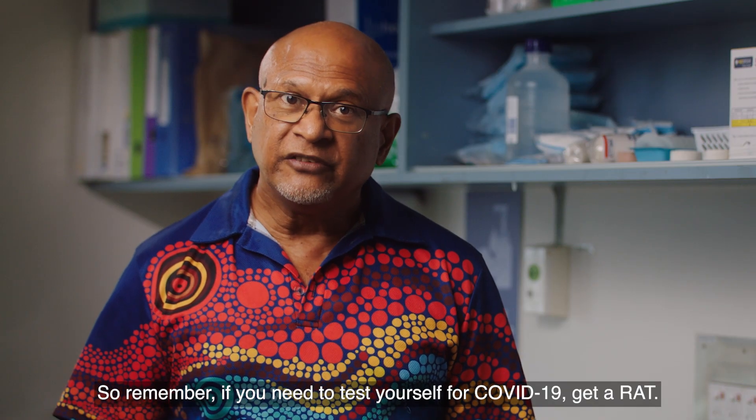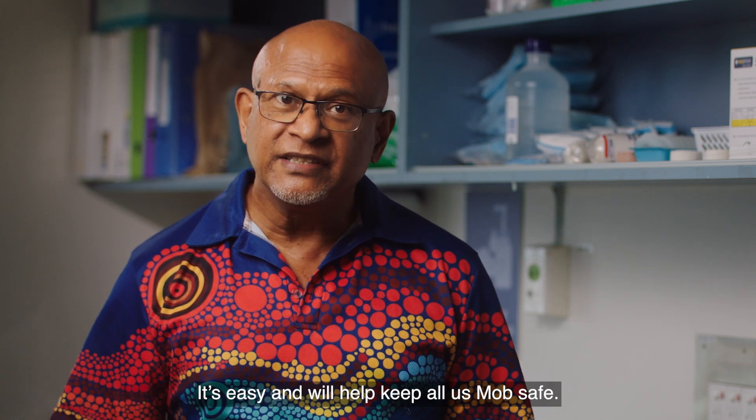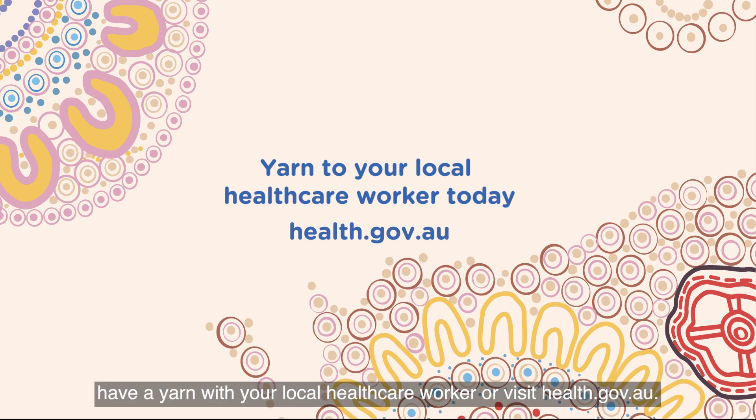So remember, if you need to test yourself for COVID-19, get a RAT. It's easy and will help keep all us mob safe. If you need to know more, have a yarn with your local healthcare worker or visit health.gov.au.